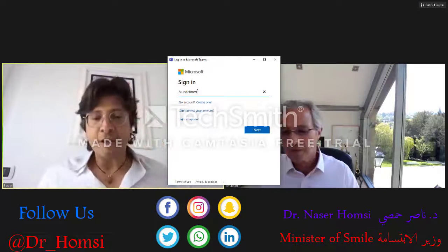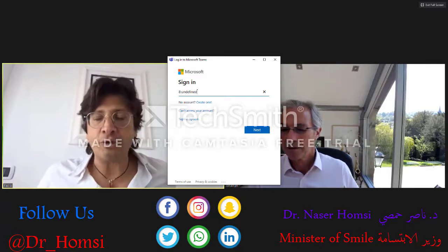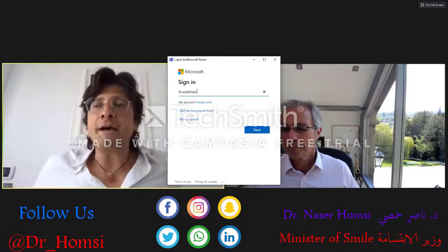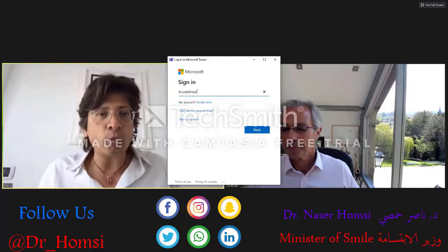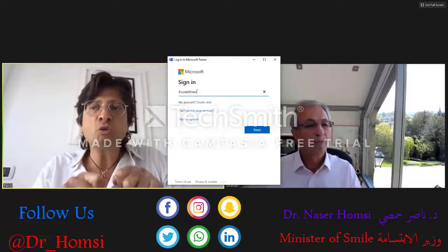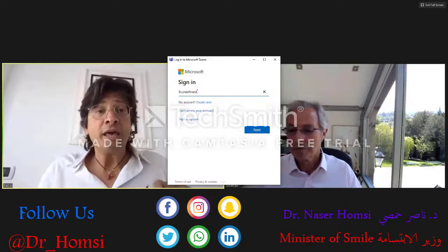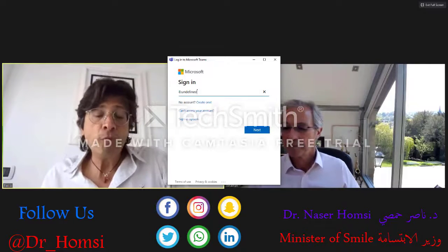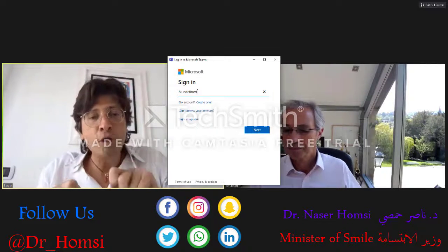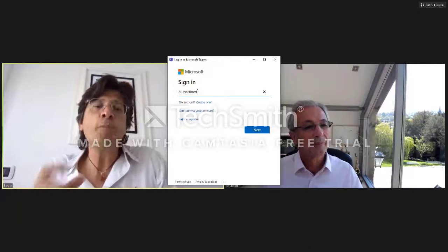It depends. For example, for the first case I showed you during the presentation of the targeted approach with TADs, I moved the canine buccally with only that wire. And you can derotate and you can twist with that wire. But in the last patient, the adult one, I had to change, because if you move the tooth and then you need a longer wire and you don't have loops available to lengthen the wire, you should place a new piece of wire.